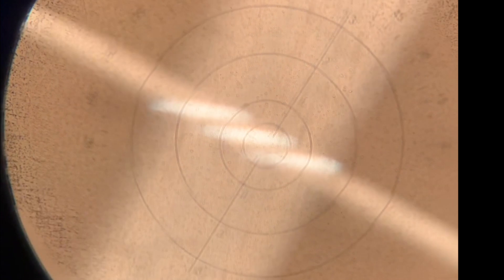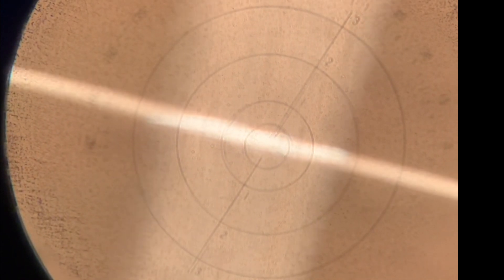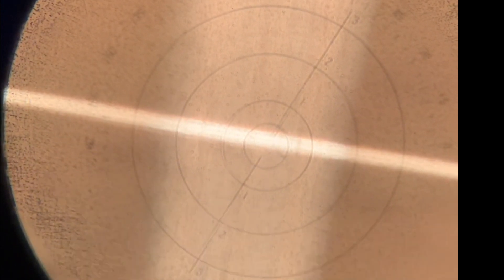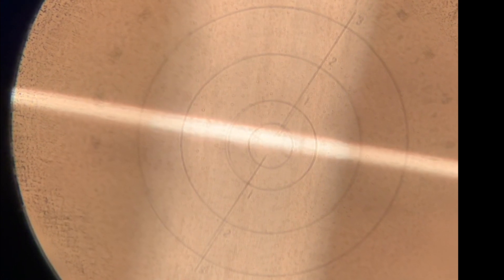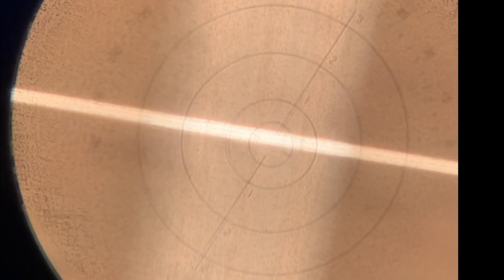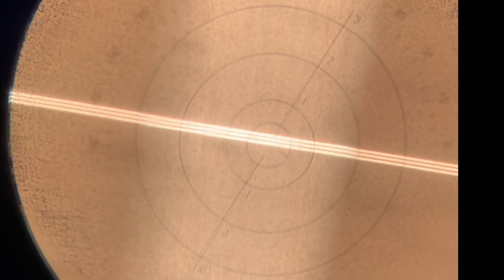First, we want to rotate our axis wheel so that we are grossly aligned with our axis. Then we'll turn our power wheel to get our sphere lines into focus.